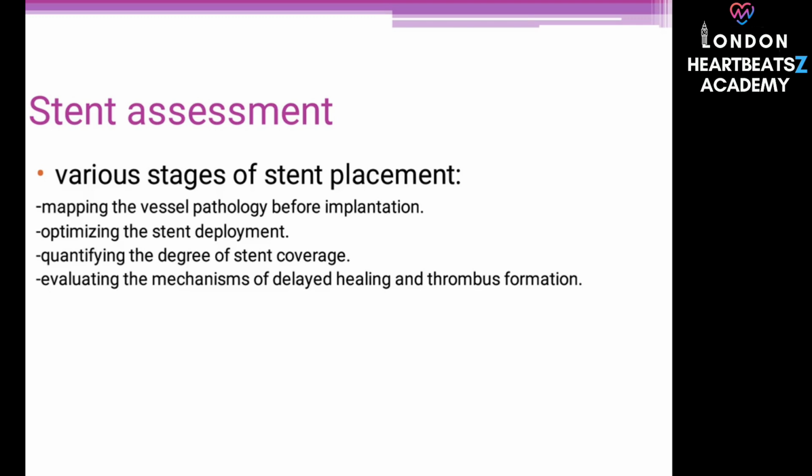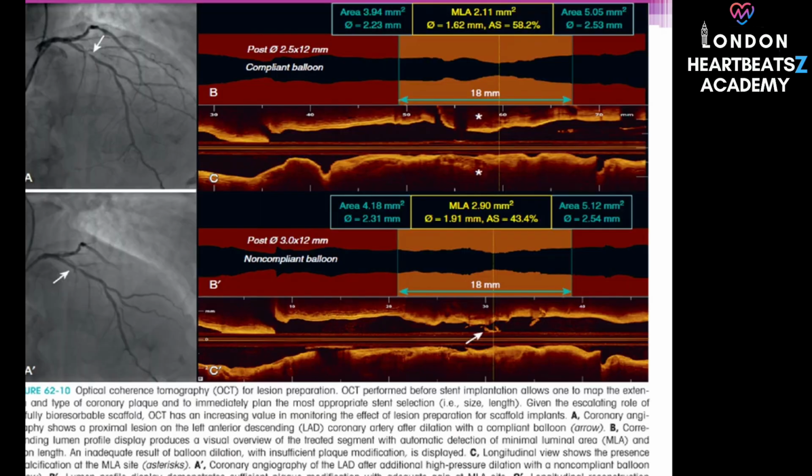Studies show OCT has much higher sensitivity for plaque rupture, 73% for OCT, 40% for IVUS, 43% for angioscopy. For plaque erosion, it's 23% for OCT versus 0% for IVUS and 3% for angioscopy. Wow, huge differences, especially for erosion. What about thrombus? For thrombus detection, OCT has a reported rate of 100%, significantly higher than IVUS, 32%, and comparable to angioscopy, also 100%. Perfect score for thrombus detection.